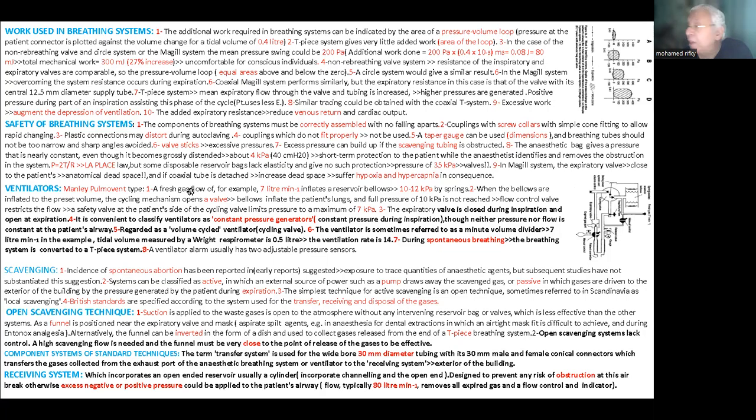You see, if this bag is not elastic enough, it will be a problem, which will much increase the pressure in the anesthetic circuit. The bag induces around 4 kilopascal pressure, you see.